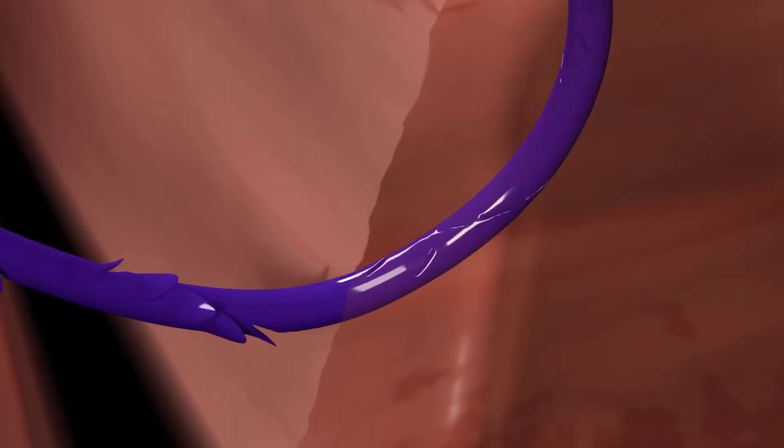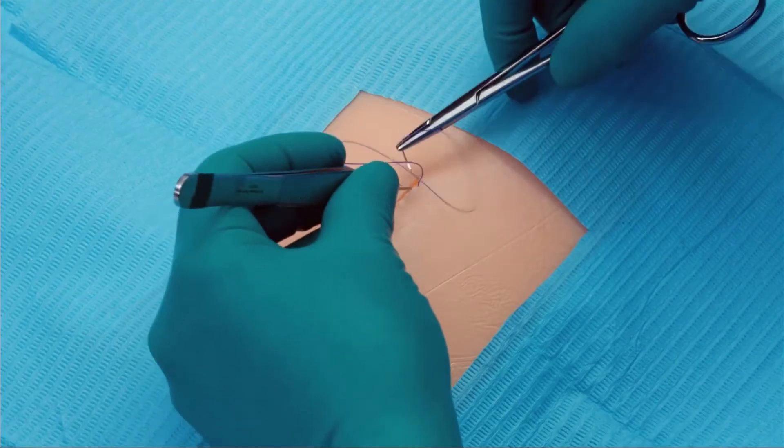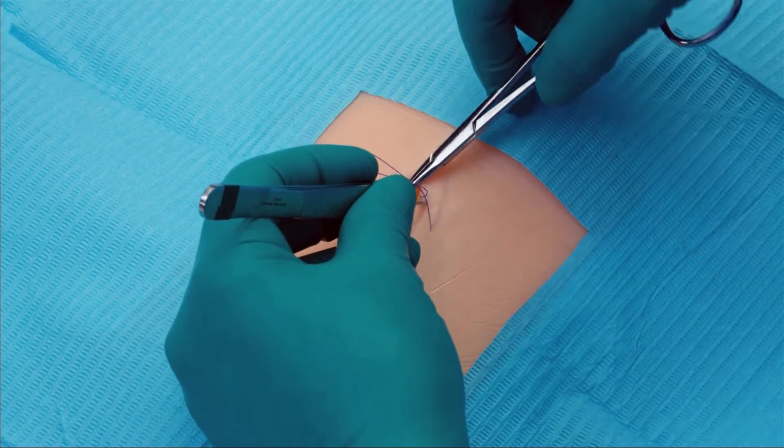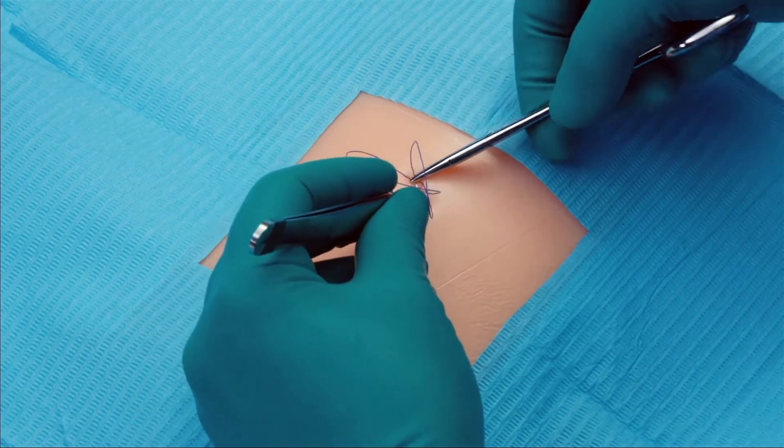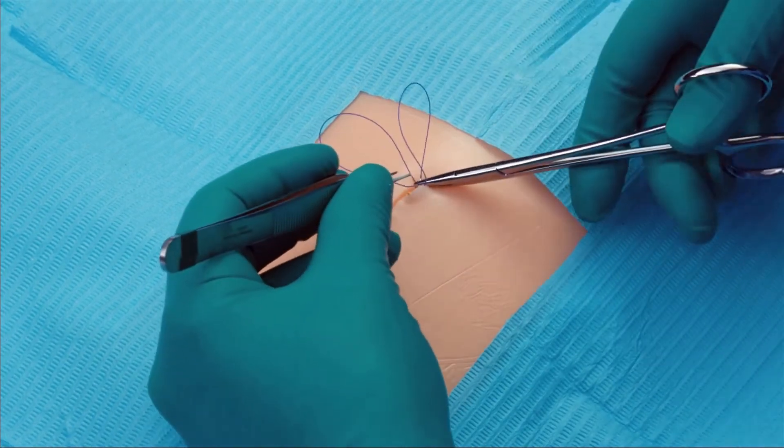The barbs on the quill device retract flush with the suture during deployment, and then anchor into the tissue for secure fixation. We then proceed with the closure of the deep dermis by running the quill device in a simple, continuous fashion.